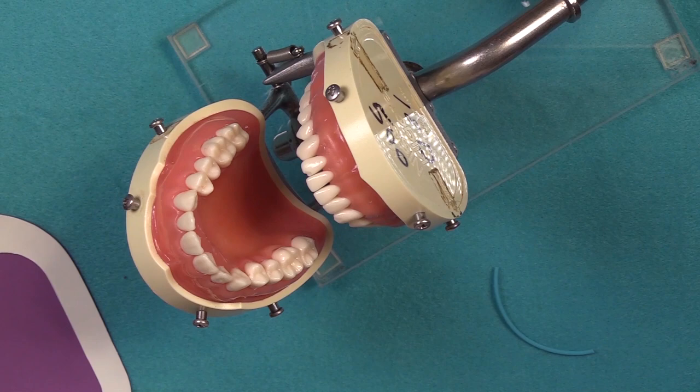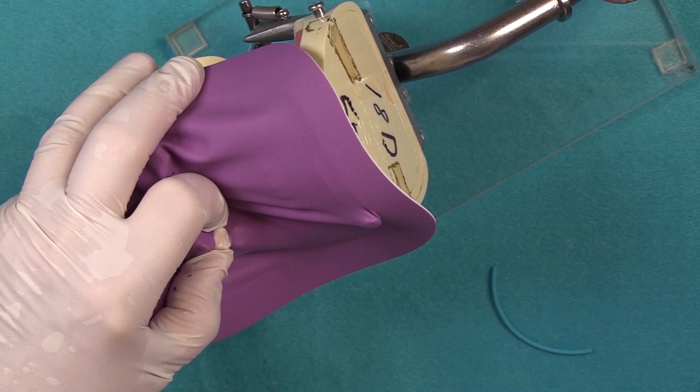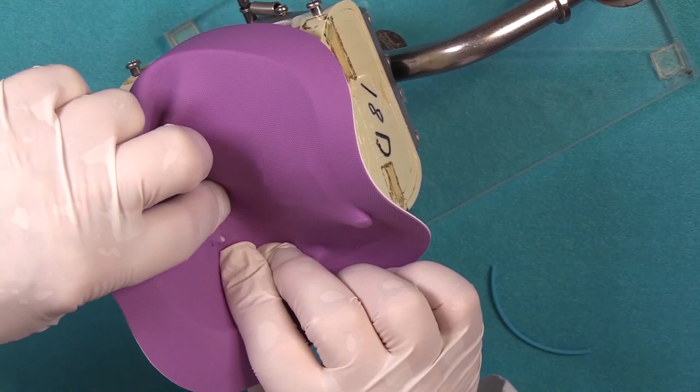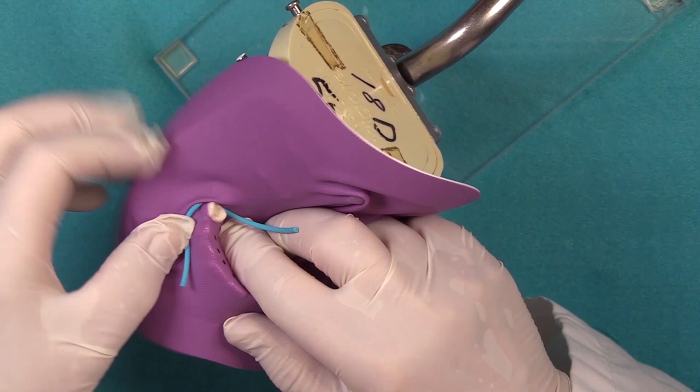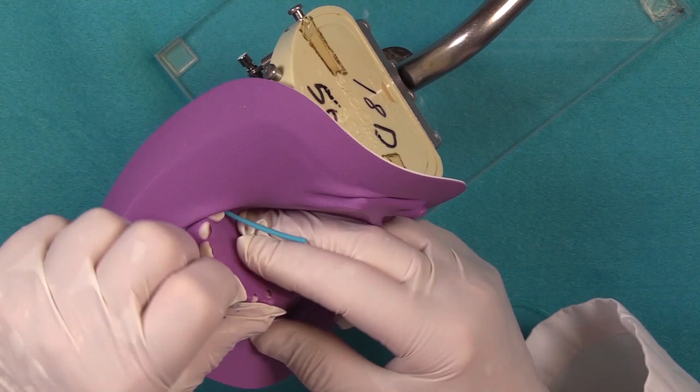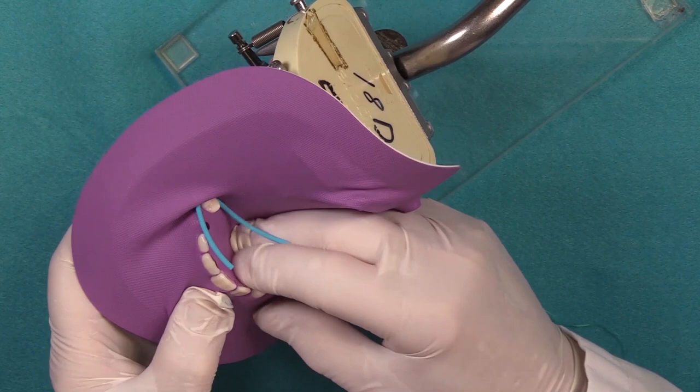We're going to place it here on the bicuspid and this is where it's helpful to have someone additionally to hold the dam down. Putting lubricant on this does help get the dam through the contact but it does make a little bit of a challenge when you're working by yourself. Bear with me a minute. I'm going to try the other side and see if I have better luck. So once I get one side in place I'm going to come over here and line up my teeth here. There we go.